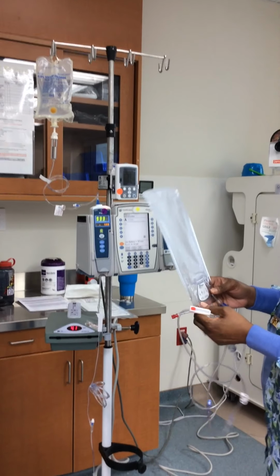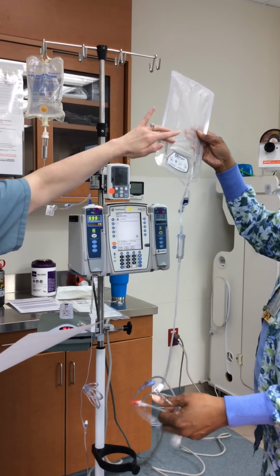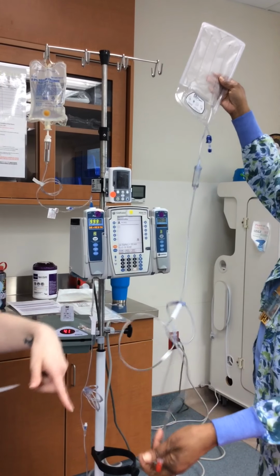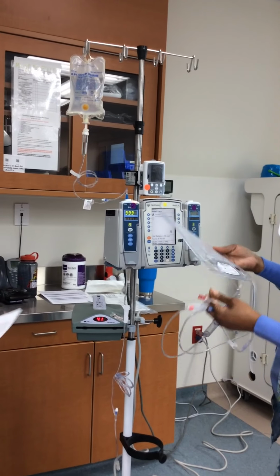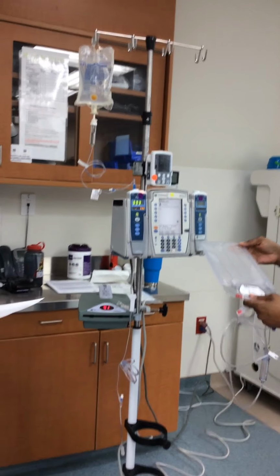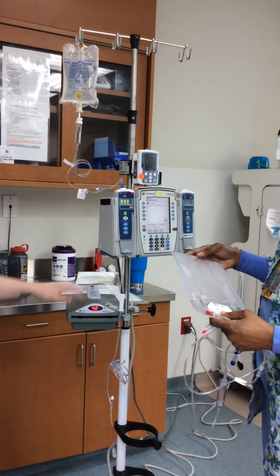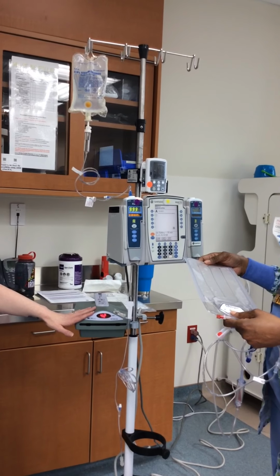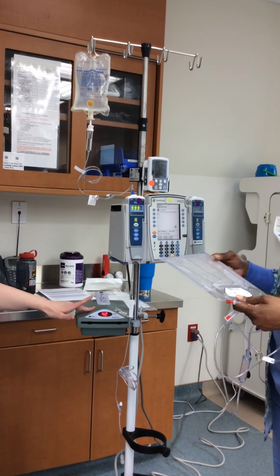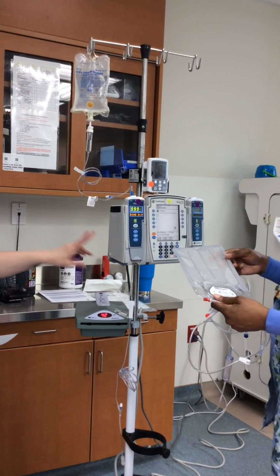The cassette takes approximately 40 mLs of fluid to fill just this part. To get it to fill all the way down, it was almost close to 50 or 60 cc's to get that entirely primed. And just so you know, the fluid rate on this, you can run this machine through your Alaris pump at KVO, or it can run up to and as fast as 9 liters an hour. So we shouldn't have any concerns about it keeping up with the Alaris pump.